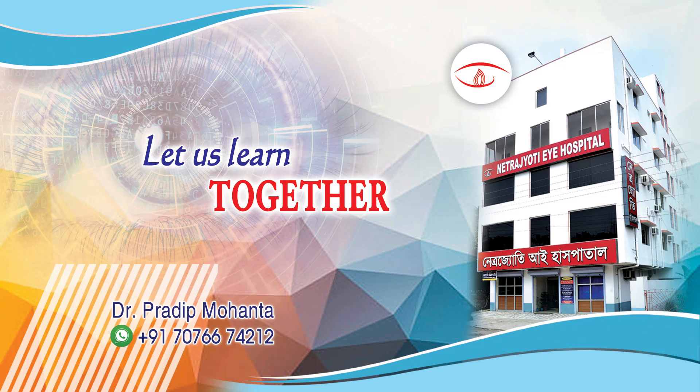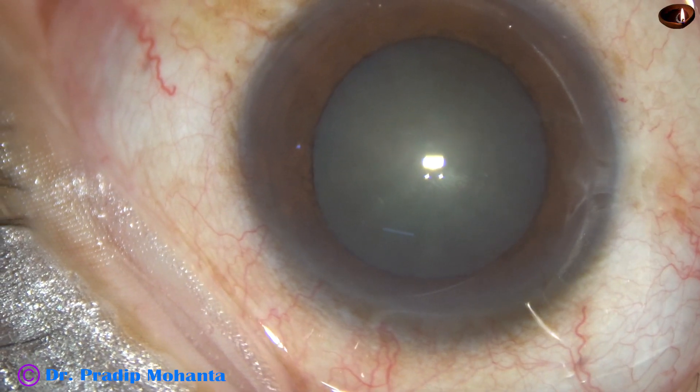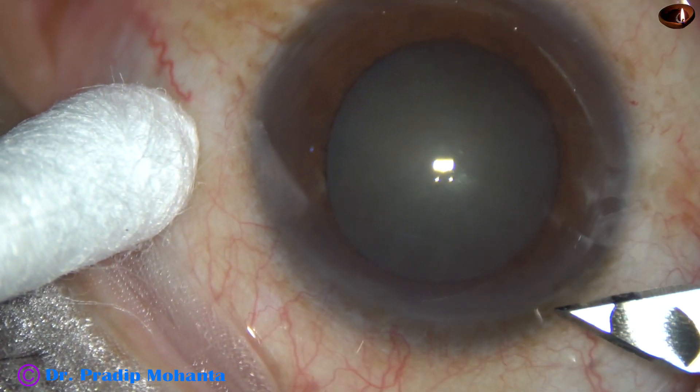Friends, welcome to my workplace at Ranaghat, West Bengal, India. This is a totally unedited phacosurgery. Let us observe the surgical steps.